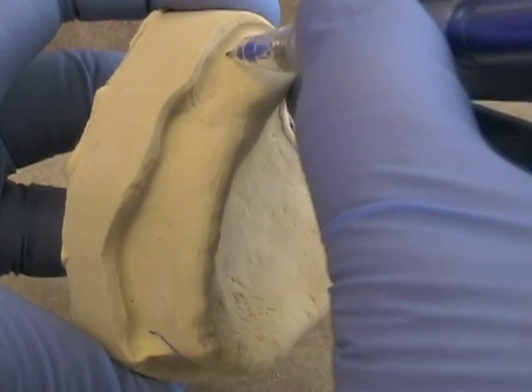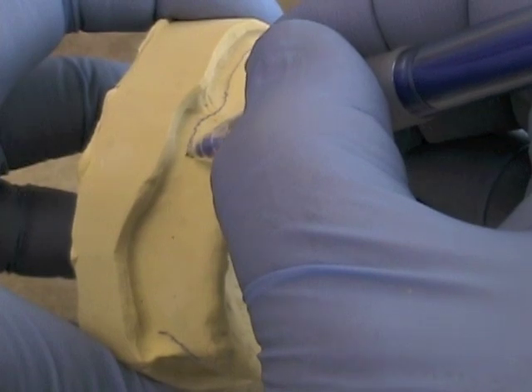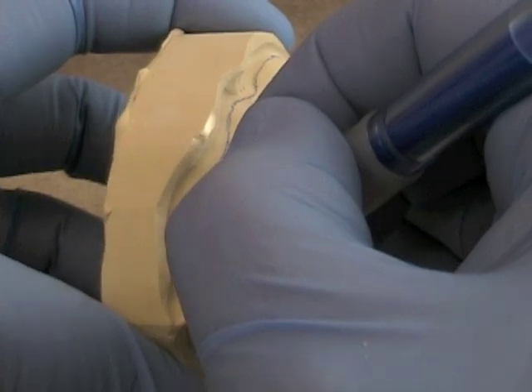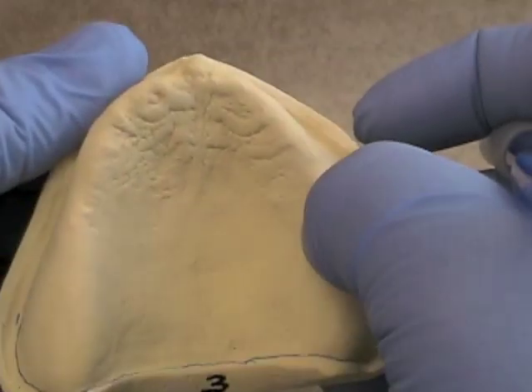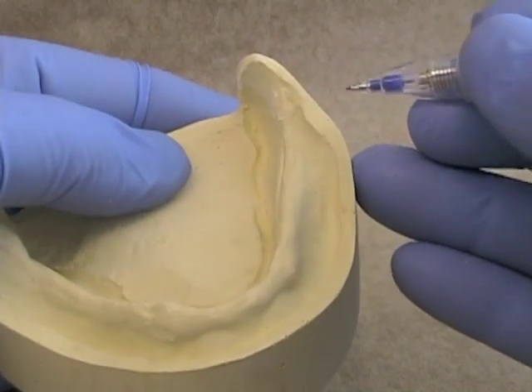Again, on the opposite side, 2 to 3 millimeters shy of the height of the vestibule. And again, following the contour of the vestibule as long as the vestibule is not distorted. So that's what the outline of our custom tray would look like in the maxilla. In the mandible, we follow a similar procedure.